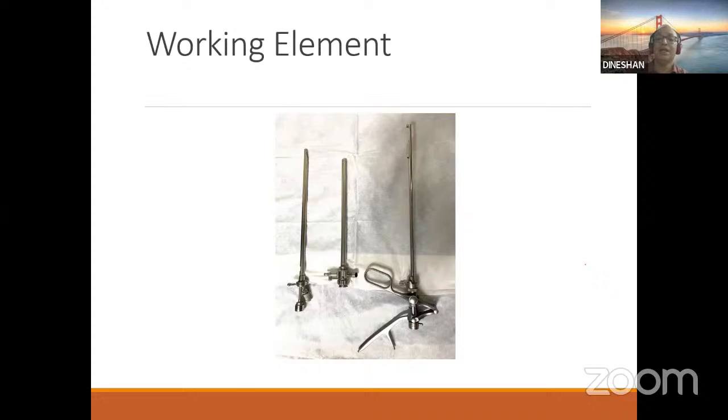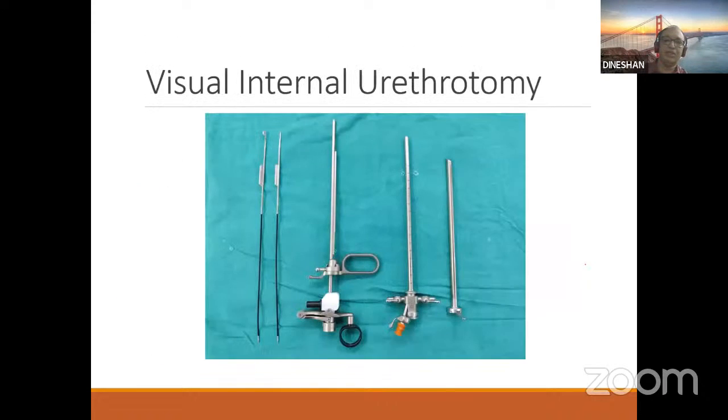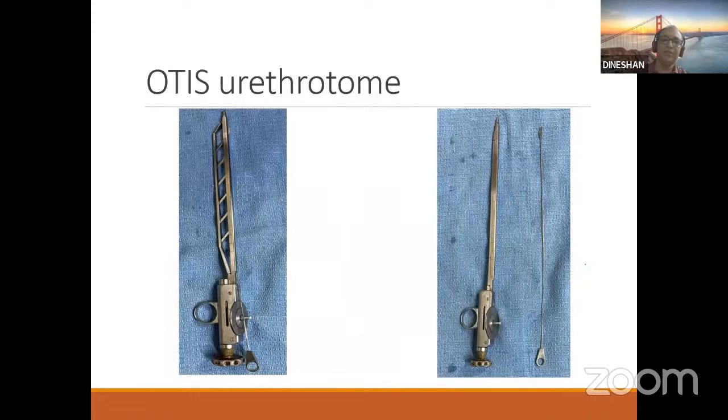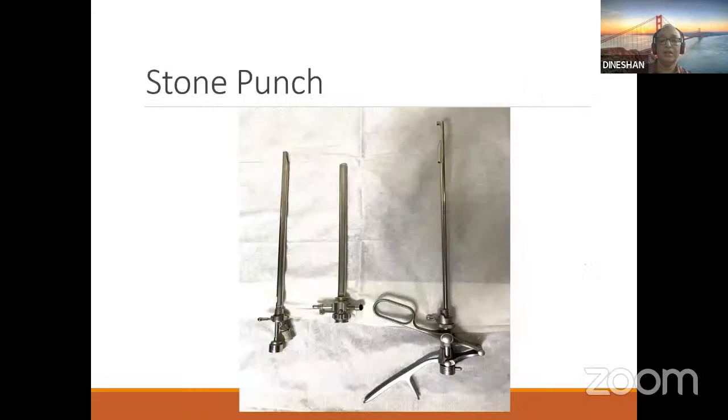And this is one for one. Here I forgot to mention that before you introduce, especially in females, when you are doing this Otis urethrotome, make sure that you fill the bladder before introducing this. Otherwise, chance of injuring the bladder is always there. Here also, you make sure that you fill the bladder before.